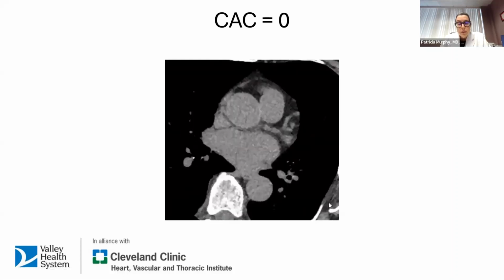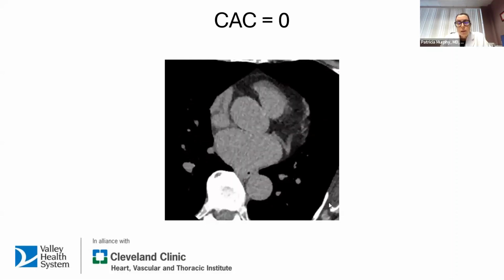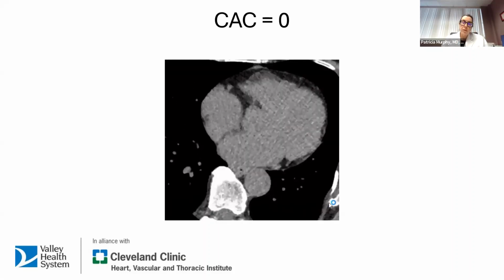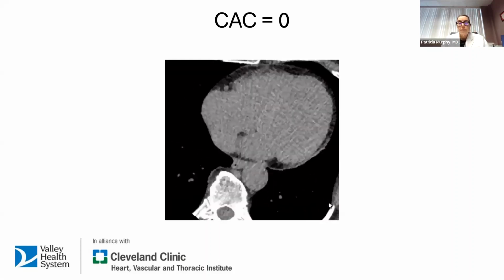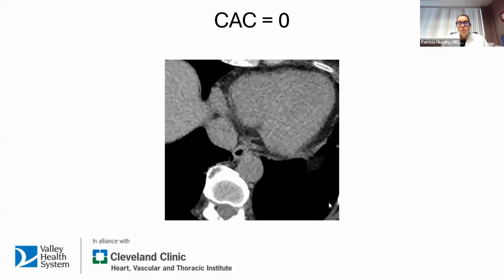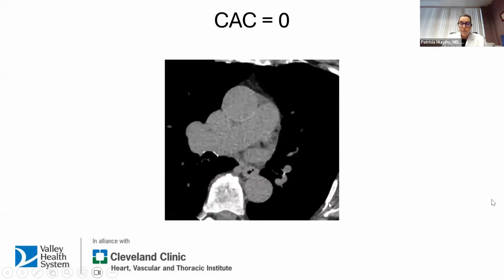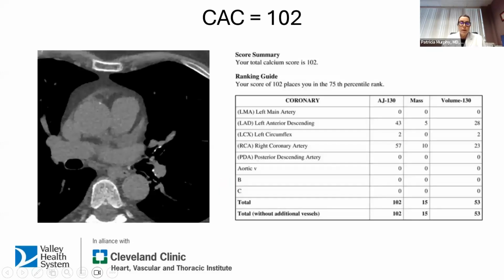Again, any calcium you see is either in bone or in the trachea or the branches of the trachea, which are the respiratory structures. And the gray we're scanning through is the heart. Now we're down below the heart, and this is the liver, and this is the intestine. So that's a score of 0. That's a good answer. The next one is a score of 102.